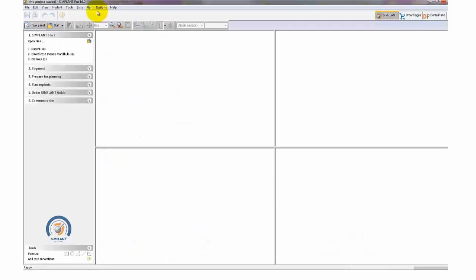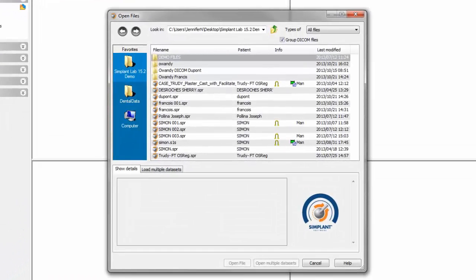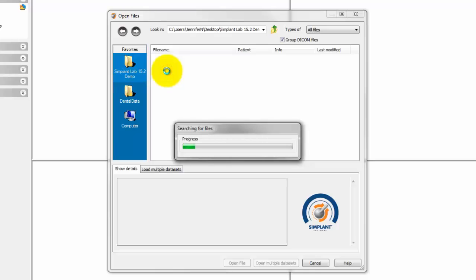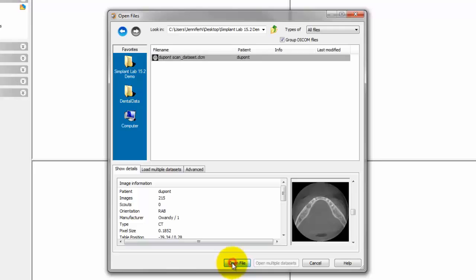To open your DICOM data, go to Open Files, select the folder in which your DICOM data is located, and then click Open File.